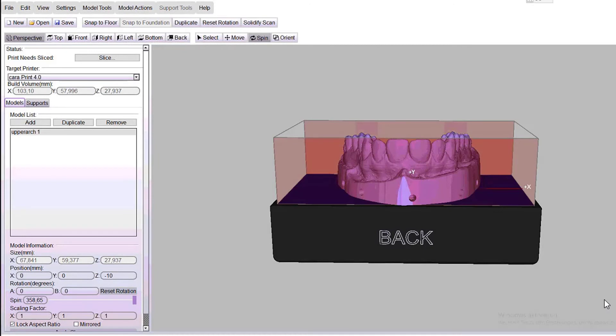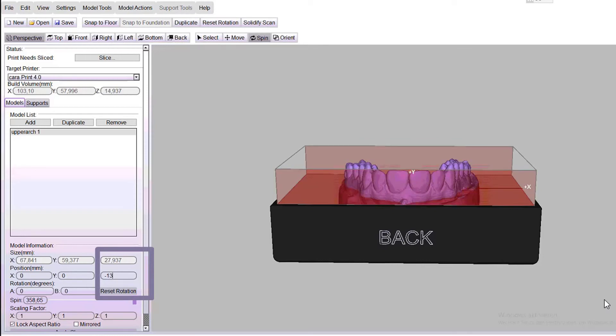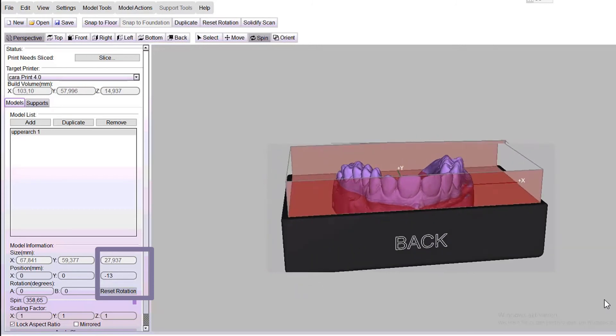On the left side, you will find the possibility to position your data record via the number fields. Make sure to subtract the values of the record height in the positioning in the minus area. Areas that penetrate the print platform are not printed.